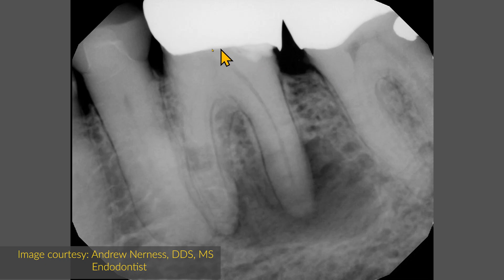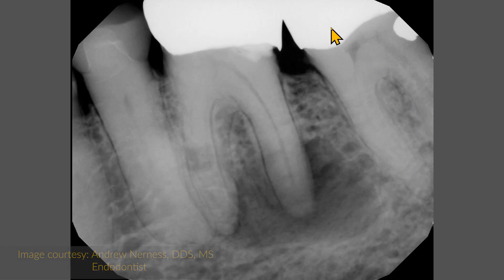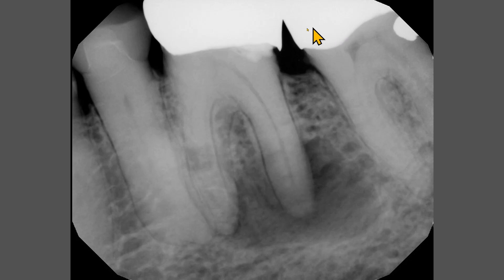This periapical radiograph was obtained to evaluate the mandibular left first molar. This area is asymptomatic. The first and the second molars have metallic crowns. A non-metallic crown is also present on the second premolar.